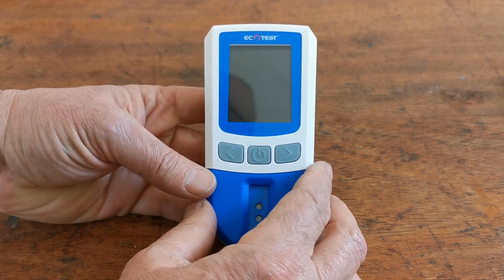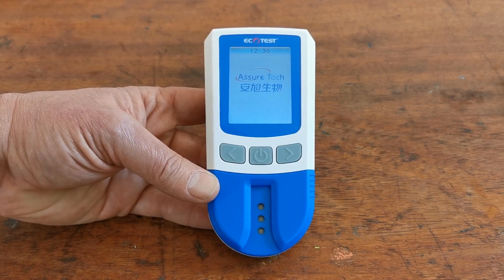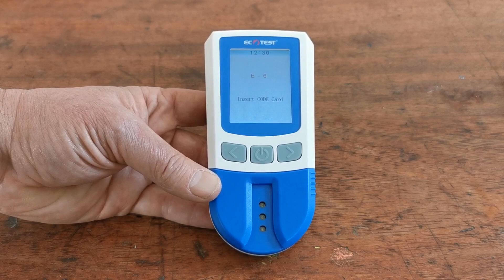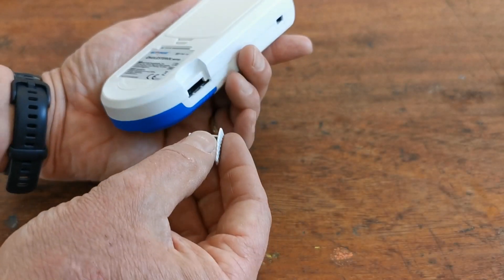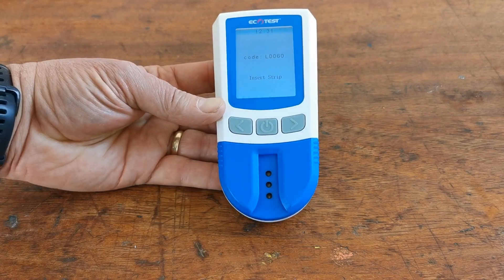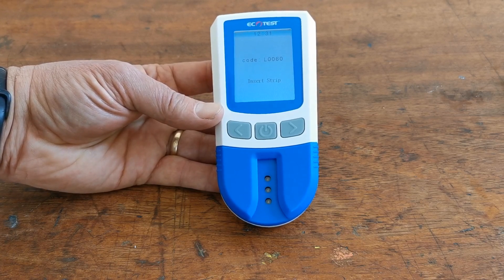With the batteries in the correct alignment, hold and depress the power button and the meter should power up. It will then ask you to insert the code chip. The code chip holds the calibration for the test strips supplied with your meter. The port for the code chip is on the side — simply insert it by pushing it in and the meter should recognise the code chip and display the code reference number.